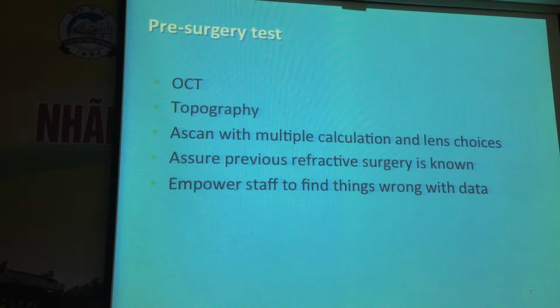We have a lot of pre-screening of patients. I'm sure you have the OCT, where you're going to actually look at that retina better. I did my cornea fellowship at UCLA. I know the very front of the eye very well. I certainly know the back of the eye, but I found that for me to give a great opinion on what it looks like back there, it could not be attained without the OCT. With the OCT, I'm not going to miss something in the back of the eye. That's very important in any cataract surgery. So if you can get all these new technologies, again, it's making it better.